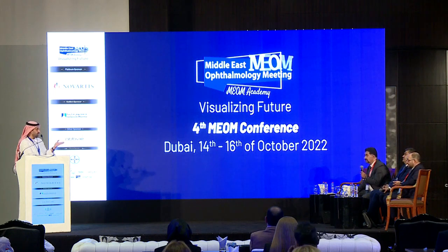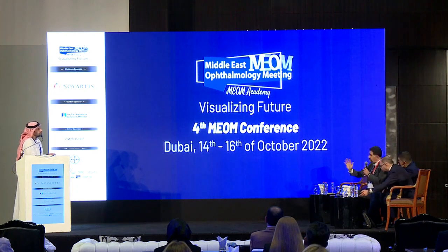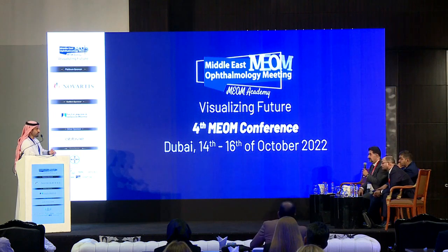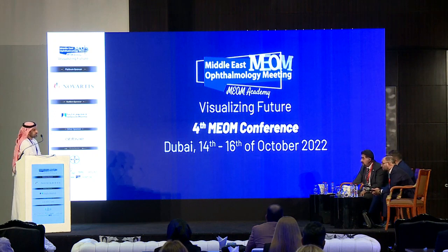This is always the case, I'm talking now beyond this, whether the patient is intolerant or the glasses are too thick. So definitely contact lens comes earlier, before the decision of going for ICL. Once we go to the ICL, then I know that I have exhausted my conservative measures. That's why I mentioned that those would be early. If the patient sees well with the contact lens, then you go with the ICL. That is one indication, definitely. Another indication is even glasses, some people are intolerant of their glasses because they have a high astigmatism of 6 diopters, or anisocoria, anisometropia, all of those. But this is not my first choice.